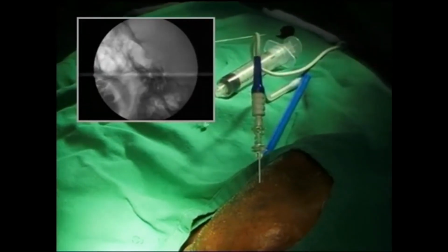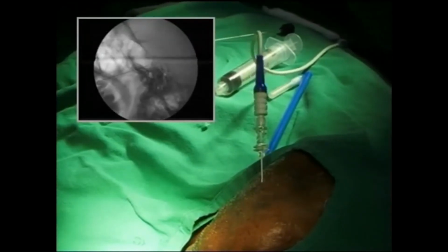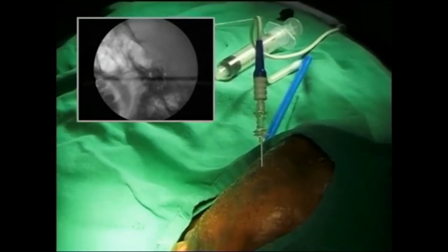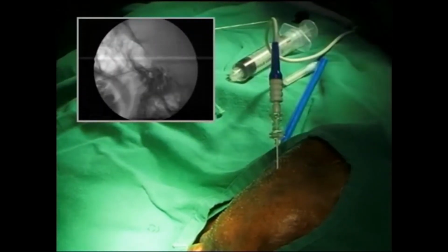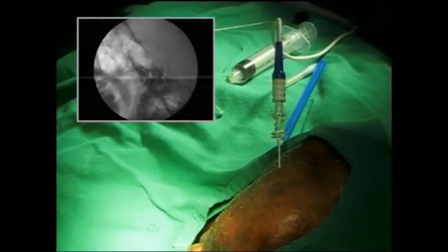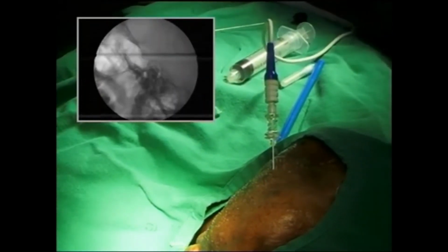Can you take another lateral shot? Lateral. Yeah, you can. Stop. Take one other. Okay, I can do it. One shot, please. Okay, that's fine now.